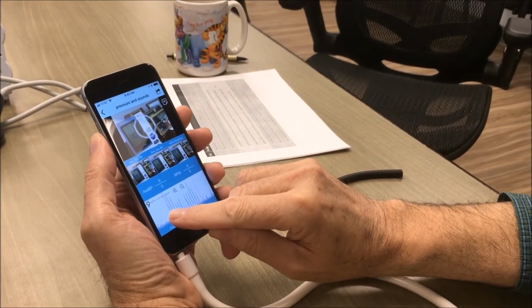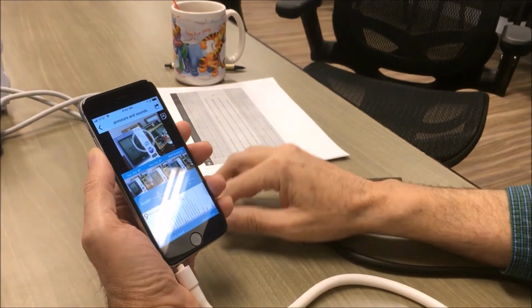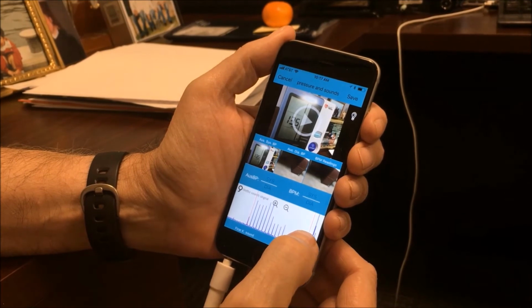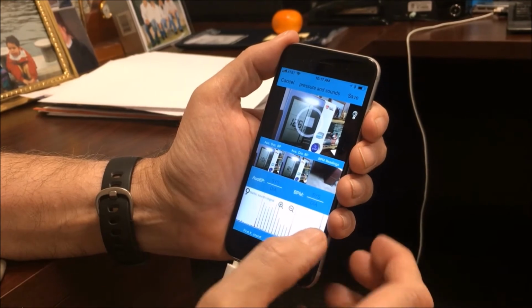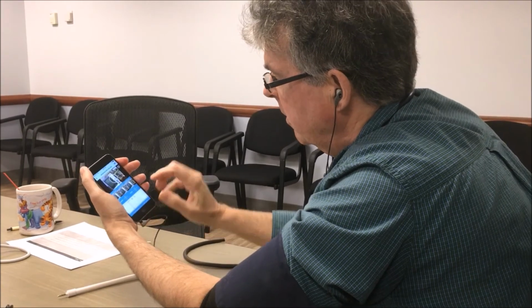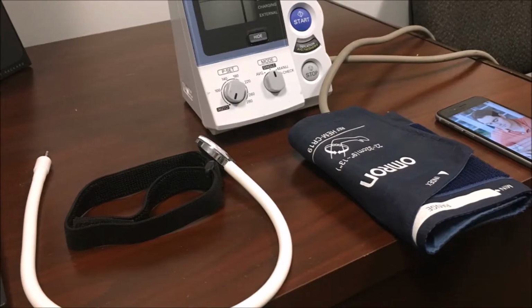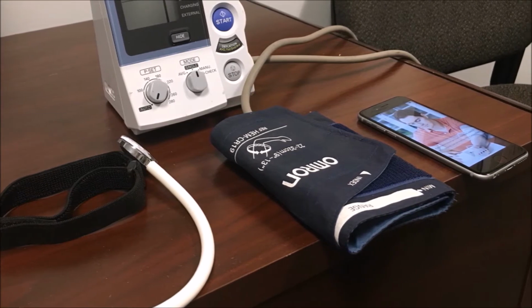Take a moment to slide your finger along the progress bar, and you'll see the exact cuff pressure that corresponds to the sound recorded by the Stetho. The higher number, the one that's visible when the first sound appears, is your systolic blood pressure, and the lower number, the last number you see just after the sound stops, is your diastolic blood pressure. If you're not sure about the sounds, insert a headphone jack into your cell phone and press playback to listen to the sound yourself to double-check and adjust the marking line if necessary. Comparing the auscultatory readings with the automated readings, you will be able to determine the accuracy of the device.